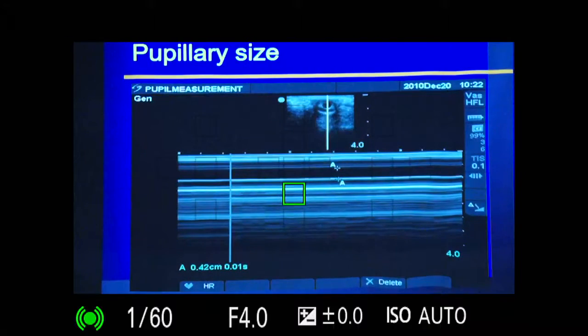And you can then measure the pupillary diameter. So instead of saying semi-dilated, dilated, you can have the nurses objectively chart it. So as soon as it starts dilating, you see 0.35, you know exactly what it is, what will happen 2 hours later. This is the objective way.